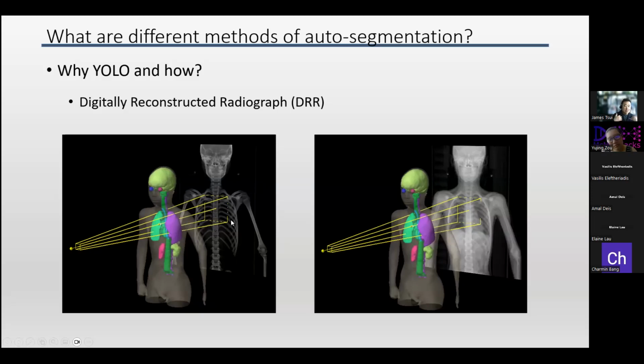But when you're doing the summation along the axis, you could clip a bunch of values to 0. For example, if I don't care too much about the bone, I care more about the soft tissue, which has a Hounsfield unit that sits around -50 to 200, for example. I can clip anything below and everything above, and I could have a more soft tissue window. In this case, it's more a lung window.